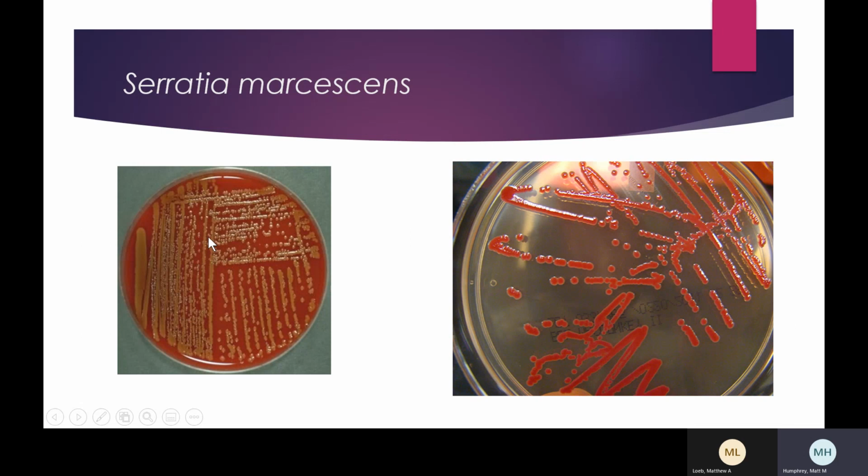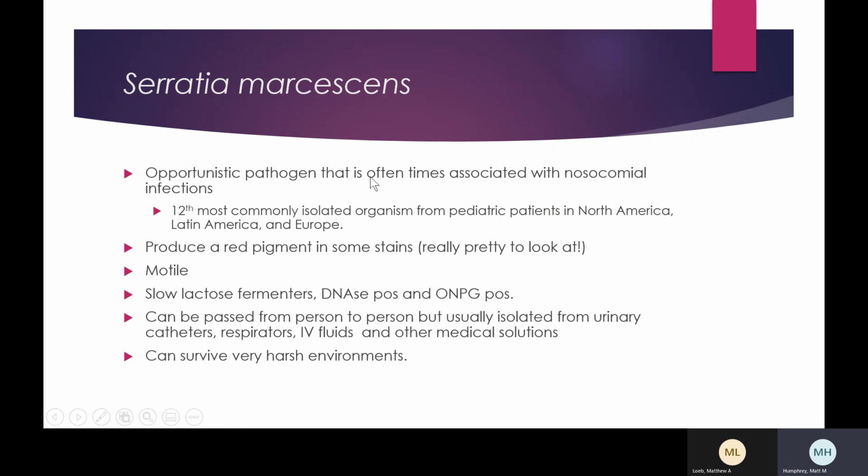And I'm just taking the dye from the agar. If I remember correctly, it's doing some sort of decarboxylation reaction where it's putting that product out on the outside. But yeah, and then this here can appear like a goldish sort of color, occasionally looking red on there as well. But that's our Serratia. It's an opportunistic pathogen, and it's associated with nosocomial infection.